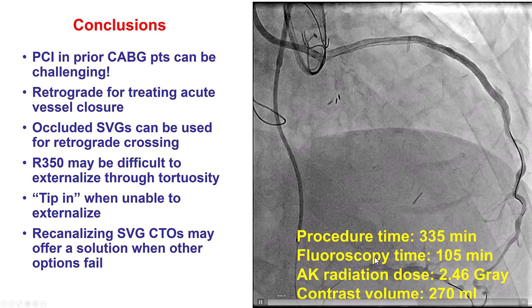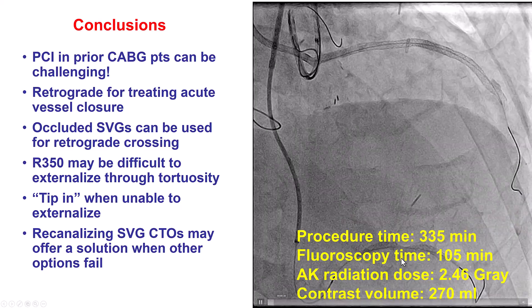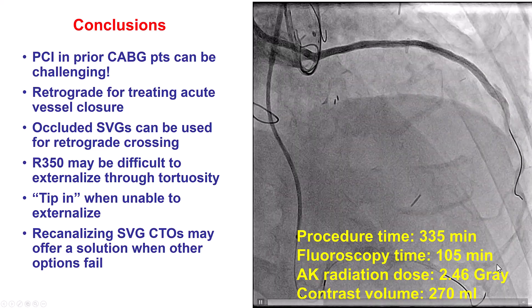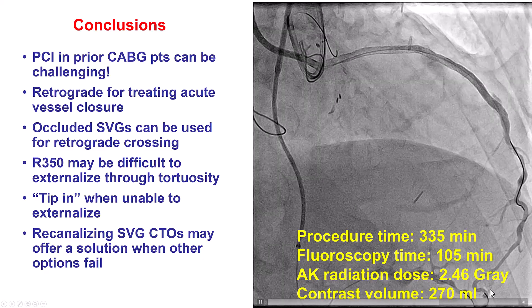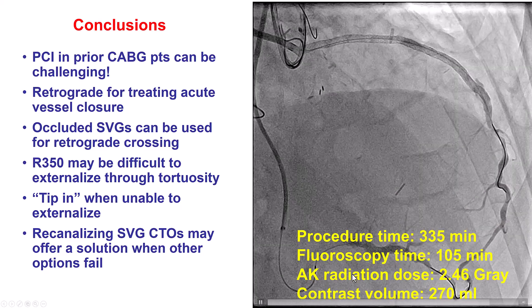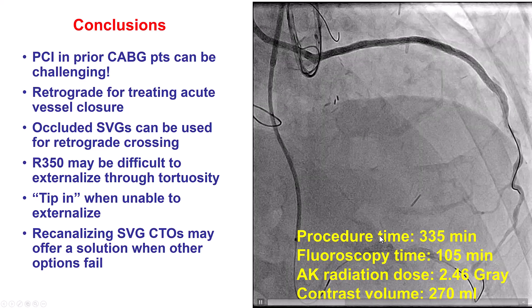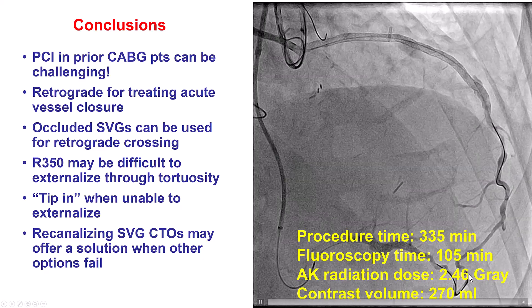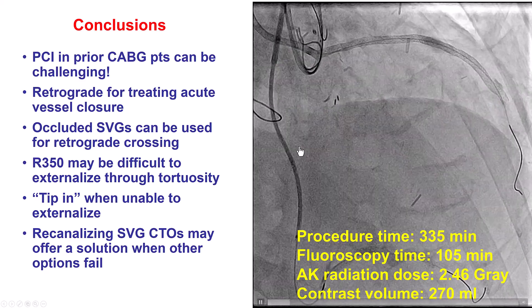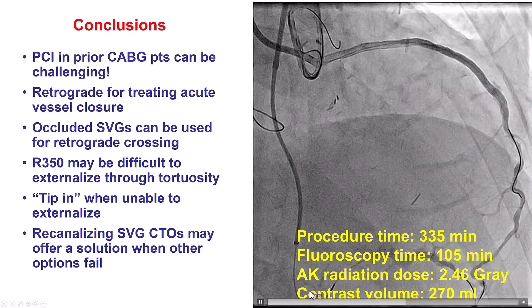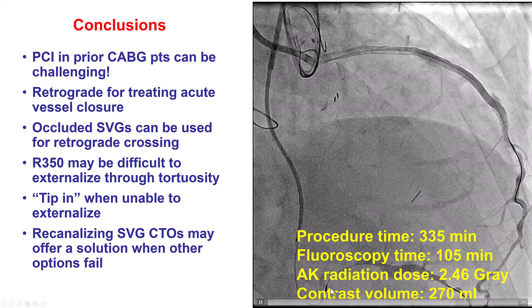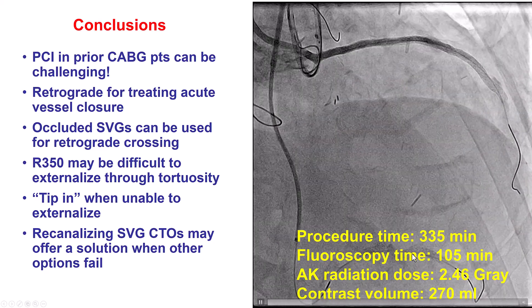What to do once we have a dissection? The key is to advance a guide wire through the dissected area to be able to stent and restore flow. Unfortunately in this case we could not advance an antegrade guide wire. The solution came from going retrograde through an epicardial collateral — not the first choice in most cases — but here it worked well. The SUO3 guide wire gave us access to the vessel and we were able to cross into the area of dissection. We did have additional challenges because we could not deliver the R350 externalization wire retrogradely, but eventually performed the tip-in technique — advancing an antegrade guide wire into the retrograde microcatheter — then advanced another microcatheter from the RCA into the LAD, externalized, placed a stent, and took care of the dissection.